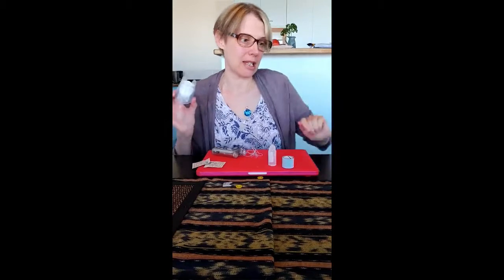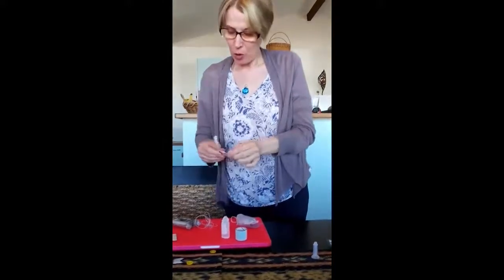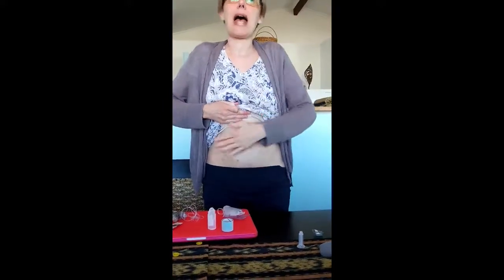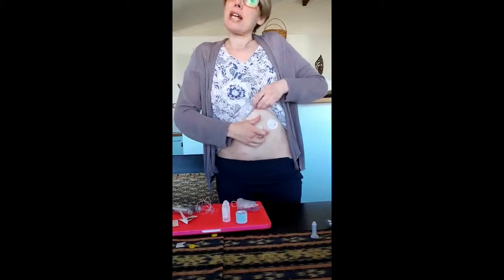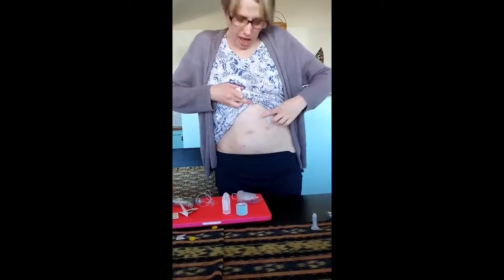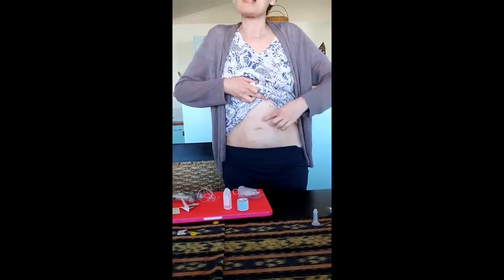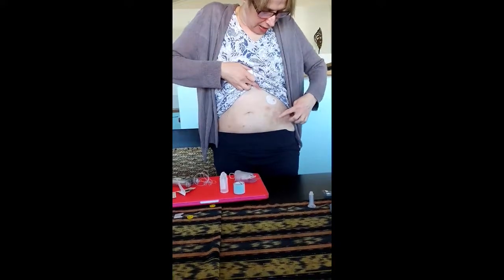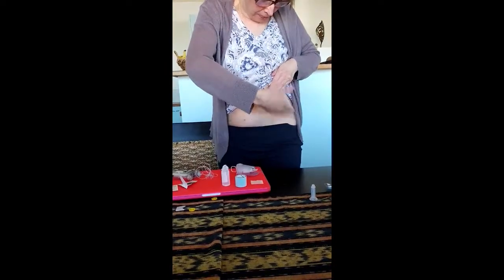It's now primed and ready to go into my body. For this device it's recommended to stand for insertion. My old one is still in — I stand up and you can see my fairly flat stomach. I always use my left side for some reason; on my right side I always get bleeders. You can see the previous one from three days ago. You don't go into scar tissue — I've got some scar there. You need to find somewhere not too close to your umbilicus — they say within two centimeters — and somewhere without a bump from a previous site.